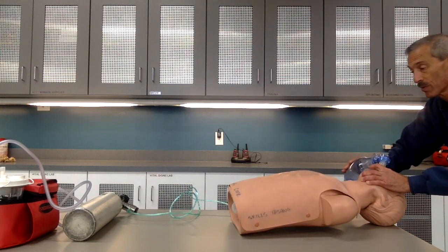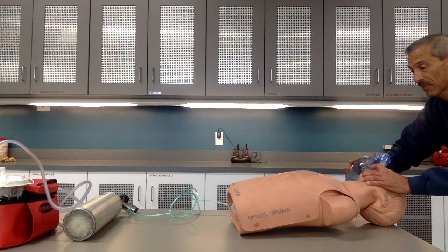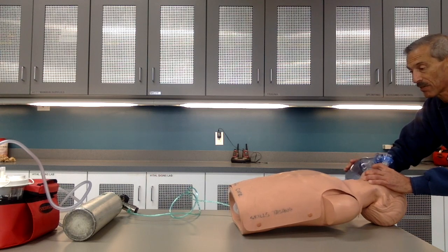One one thousand, two one thousand, three one thousand, four one thousand, five one thousand, one one thousand, two one thousand, three one thousand, four one thousand, five one thousand.